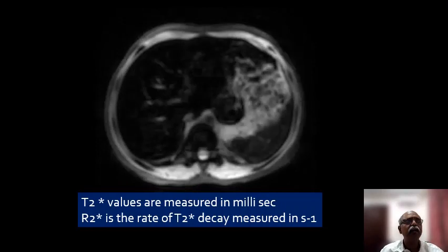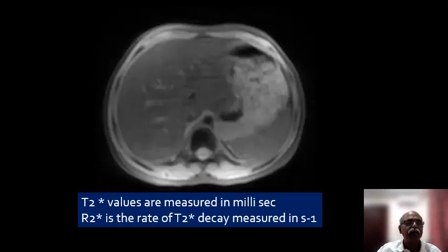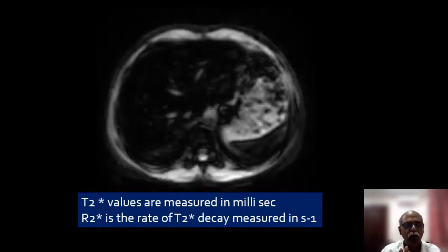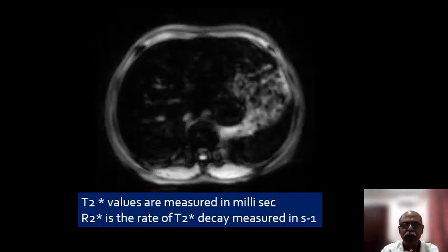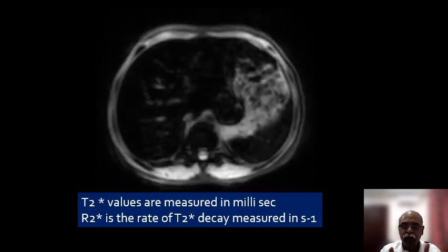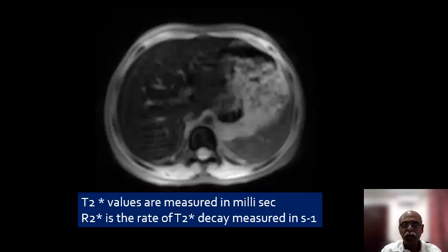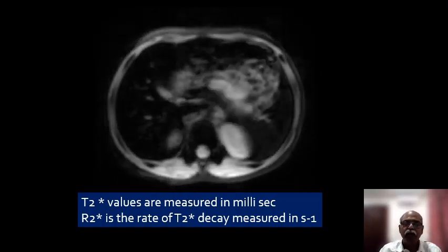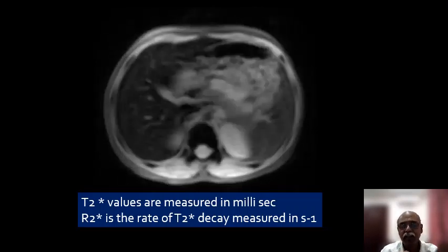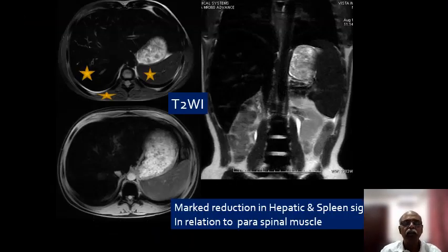Now, this is a movie showing you the fast decay. You can see the fast decay of the liver parenchymal signal that happens when multiple TEs are given. The rate of decay, that means the rate at which the signal drops, is known as R2 star, and that is measured in hertz, that is 1 per second. T2 star values are measured in milliseconds, and that is how you quantify the liver iron.